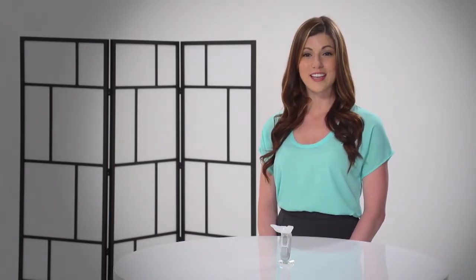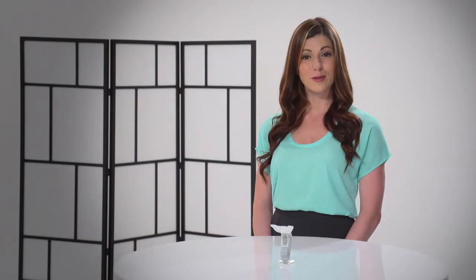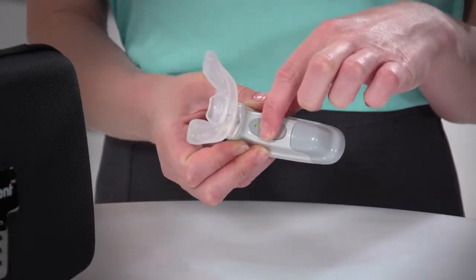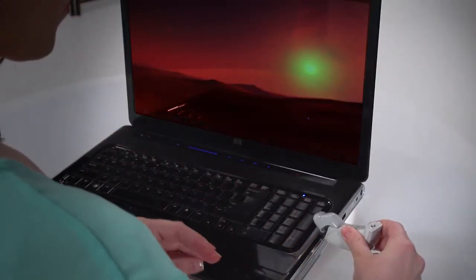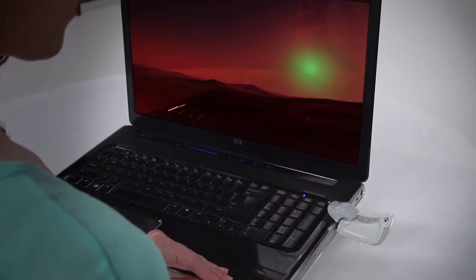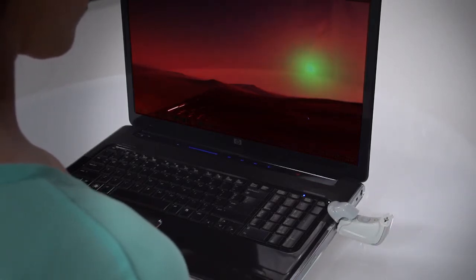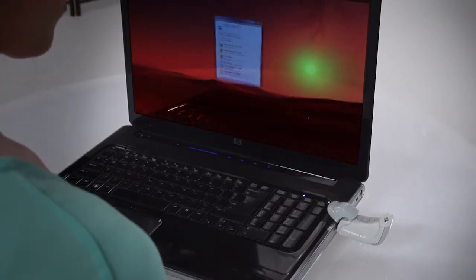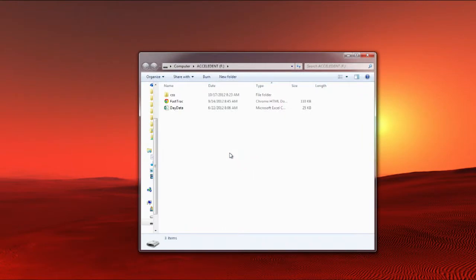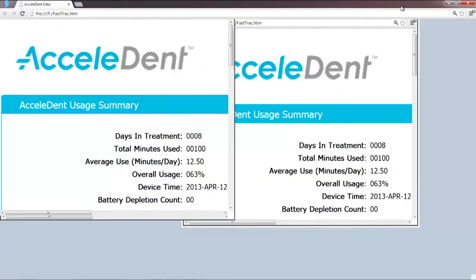Another great feature is the FastTrack report, which allows patients and doctors to track usage throughout treatment. To access the FastTrack report, turn the activator off and plug it into an open USB slot on your computer. The first time you install the FastTrack report, it may take a few seconds to load the appropriate information. The FastTrack is compatible with both PC and Mac. When you've opened the USB's Accelident file, click on the FastTrack icon to view the usage report.